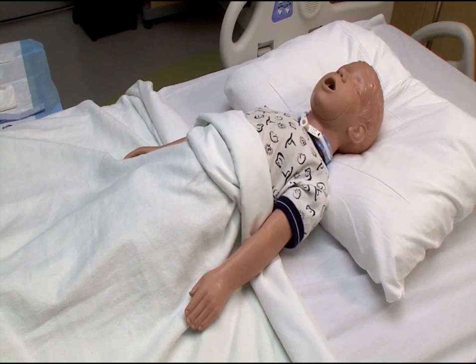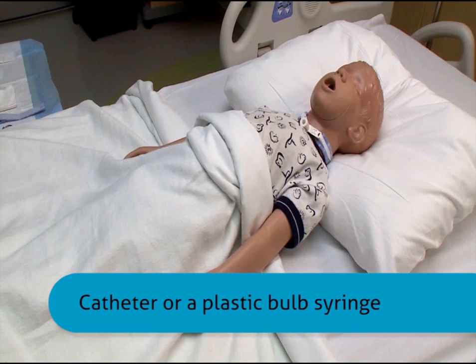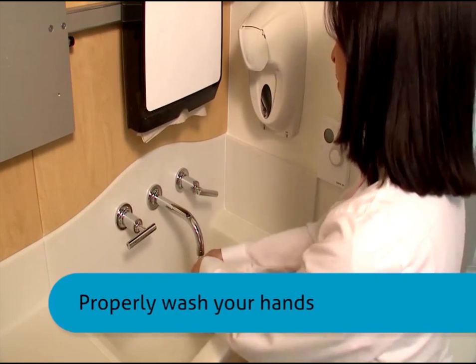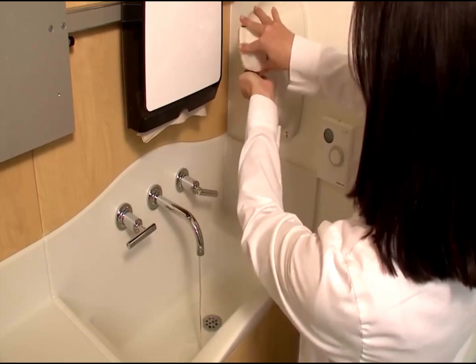There are two ways to suction a tracheostomy: with a catheter and with a plastic bulb syringe. In this video, we will cover both methods. Whether you use a catheter or a plastic bulb syringe, begin by properly washing your hands.